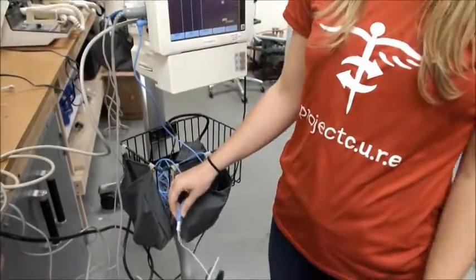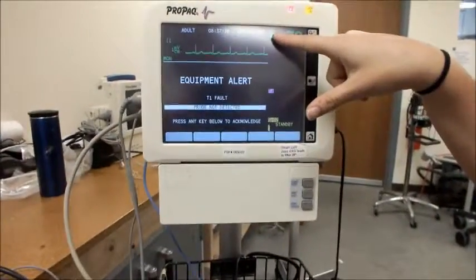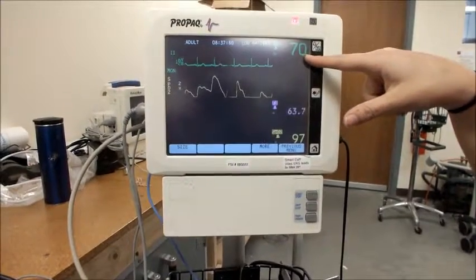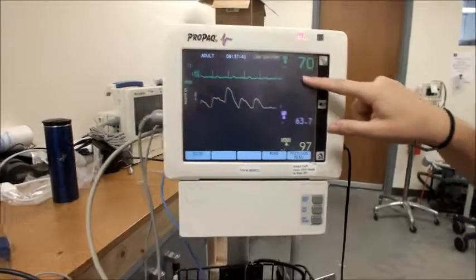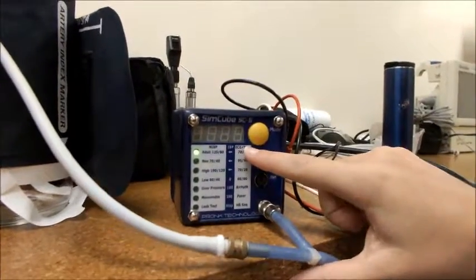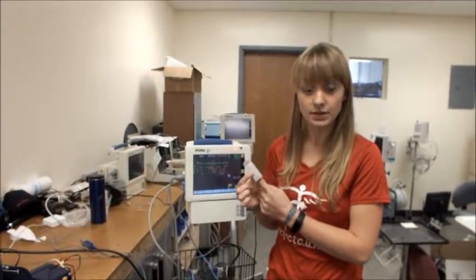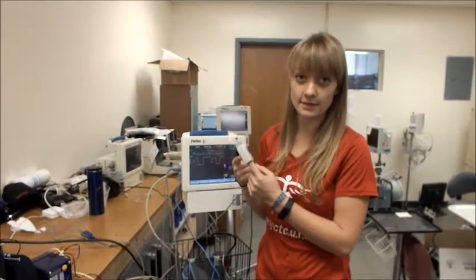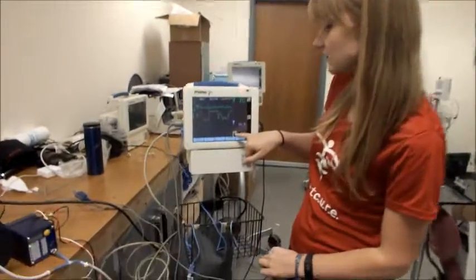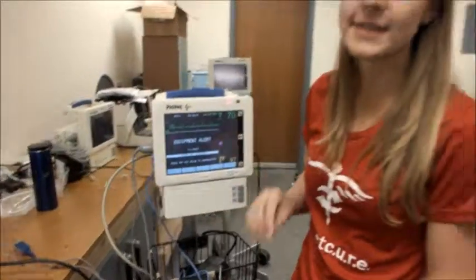Now that all of our cords are connected, we're ready to test the device. The first thing you should notice on your EKG machine is the heart rate area, which should show 70 BPM. This should correspond to the same number on your SimCube under ECG or respirations. The next easy thing to test is your SpO2 — simply put your finger into the finger probe and wait until the SpO2 displays a number. This number should be higher than 90; if it's not, you should ask for help.